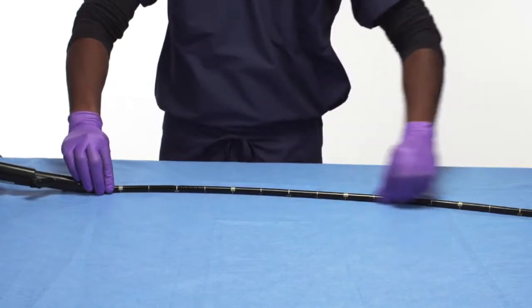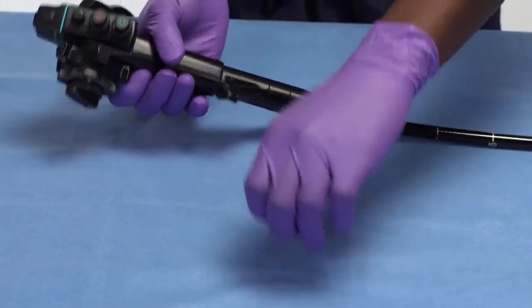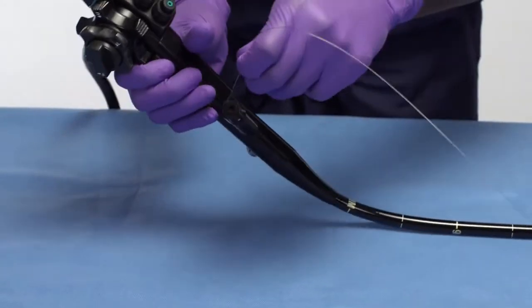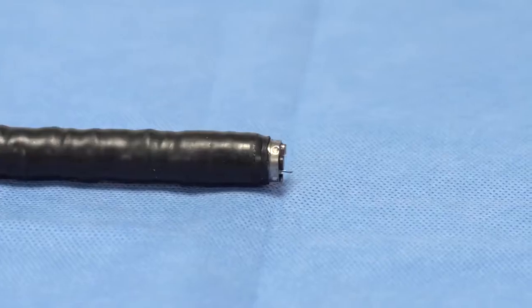Be sure to straighten the endoscope. Feed the tripwire through the biopsy valve and then through the working channel of the endoscope until the wire loop exits the distal end of the endoscope.